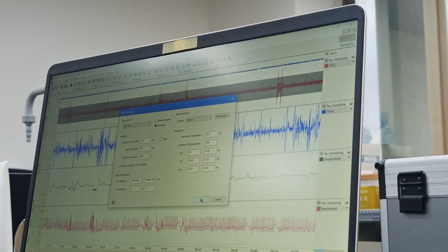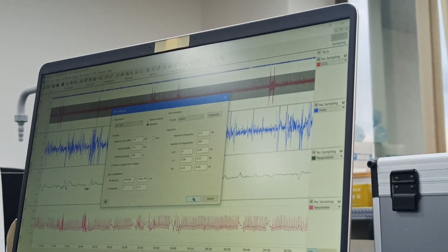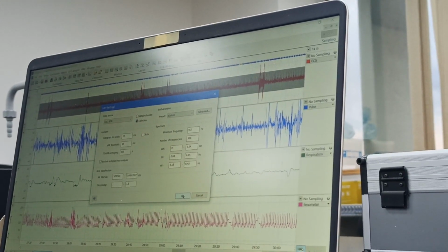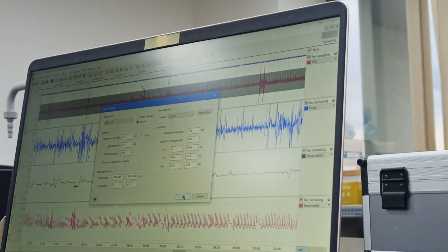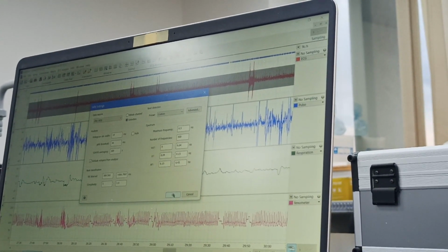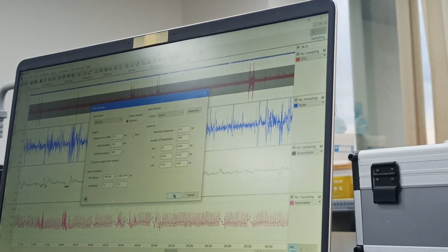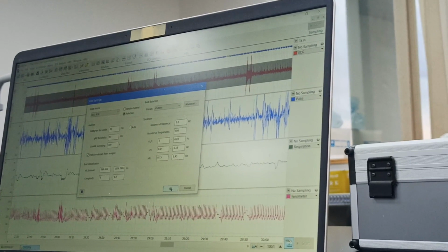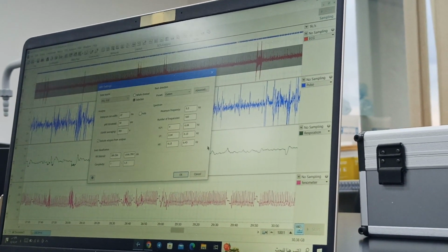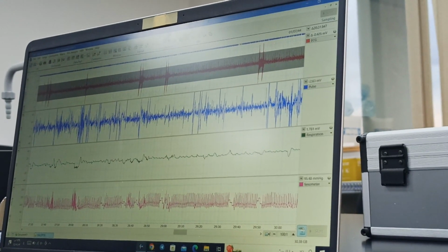Yeah, exactly. That's what I meant. So 1 minute of the base and 1 minute of the deep breathing. Yeah, that is for comparison of base and deep breathing. Yes, exactly. But otherwise, because you have to give another parameter that your baseline HRV was this, that should be the 5 minutes one. Okay. But when we are making a comparison of deep breathing with normal breathing, that should depend on the time itself for the maneuver. Okay. So for each, we'll go through all the baselines for the parameters we need and the maneuvers itself with the base. Okay.